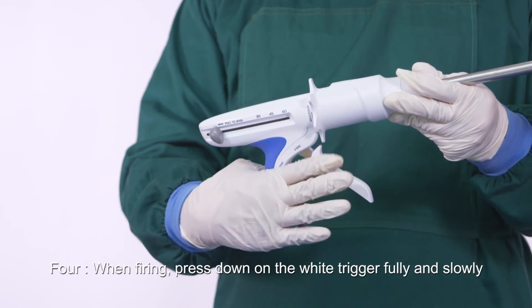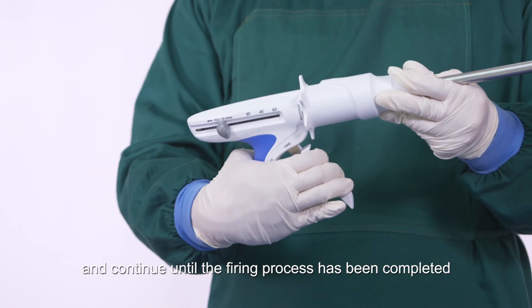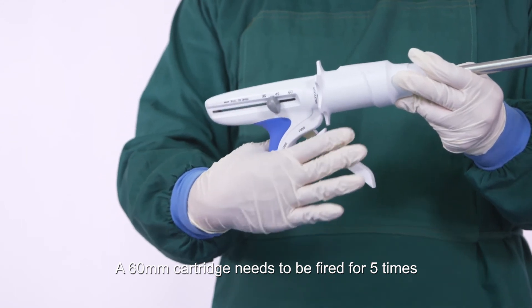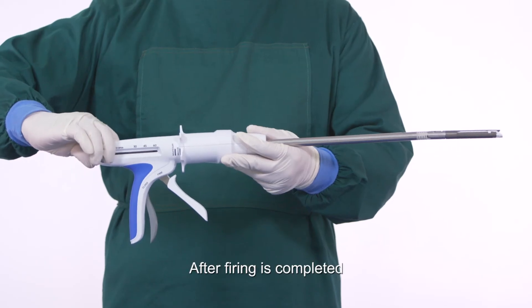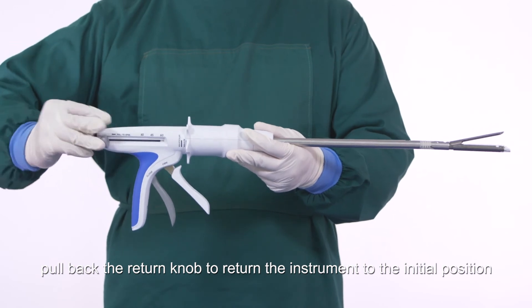When firing, press down on the white trigger fully and slowly, continuing until the firing process is completed. A 60 millimeter cartridge needs to be fired five times, and a 45 millimeter cartridge needs to be fired four times. After firing is completed, pull back the return knob to return the instrument to the initial position.